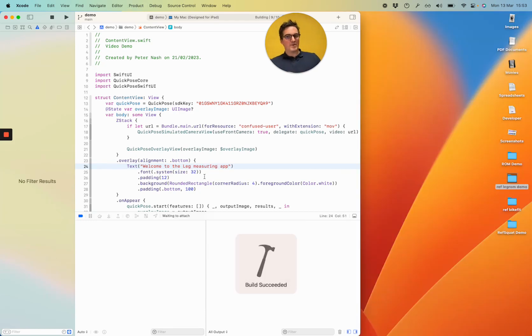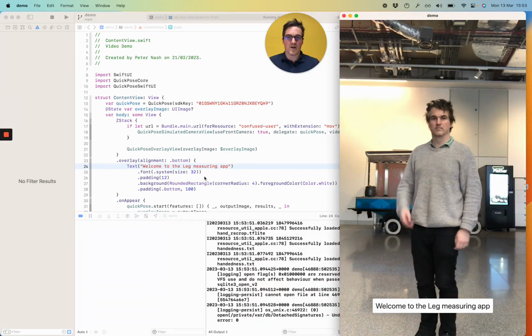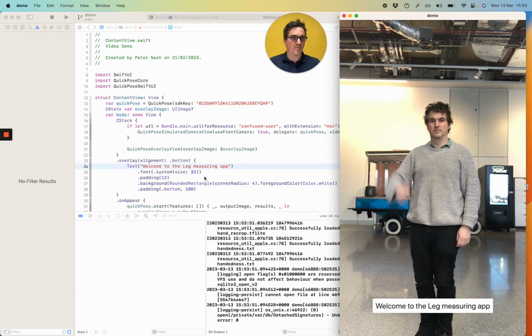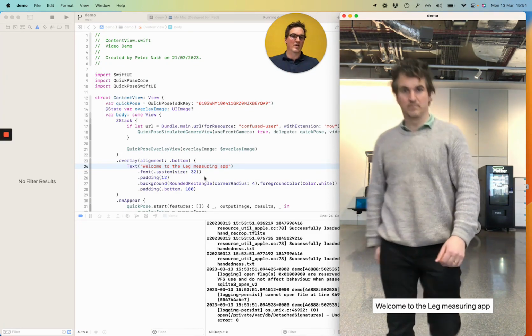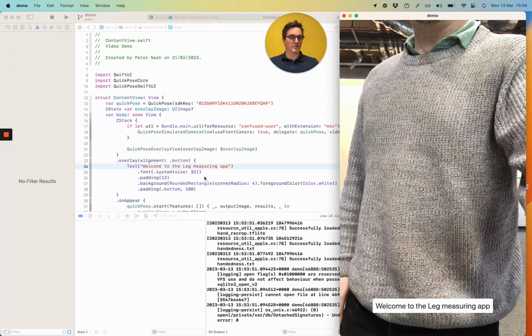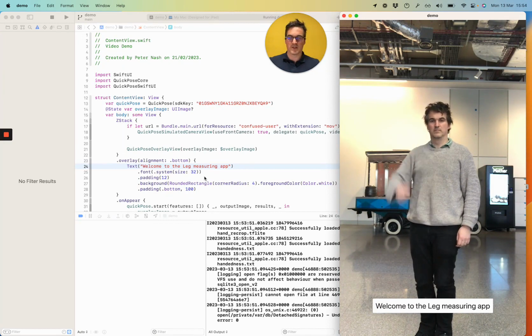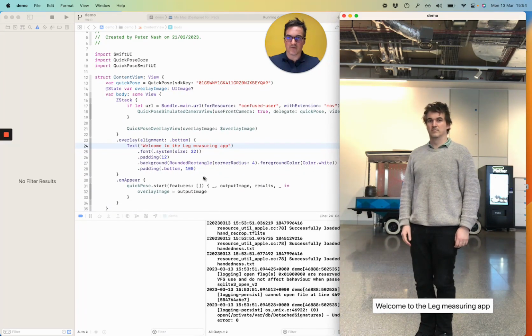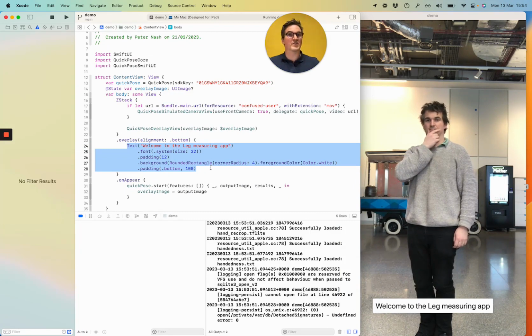Now the user will probably still be a bit confused after the leg measuring app prompt. And what I'm doing here is creating kind of agile kind of UX experience based around these sorts of videos, because if in doubt, the user's probably confused. So if we've got very clear prompts, we're solving a lot of those problems. Okay, so we've got this step here, welcome to the leg measuring app. So what's the next step?